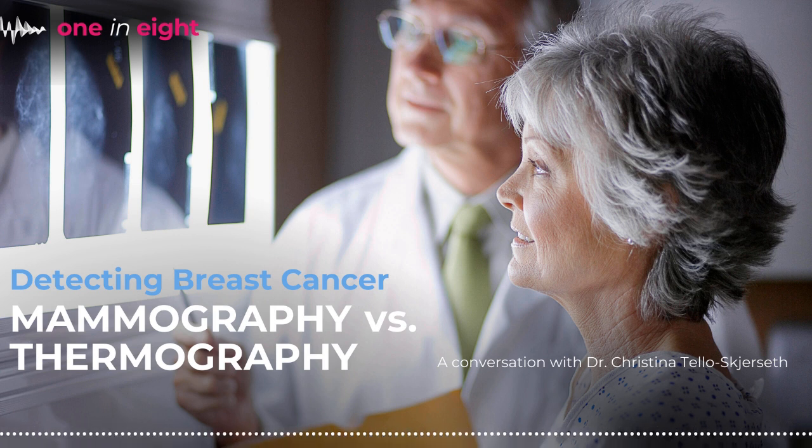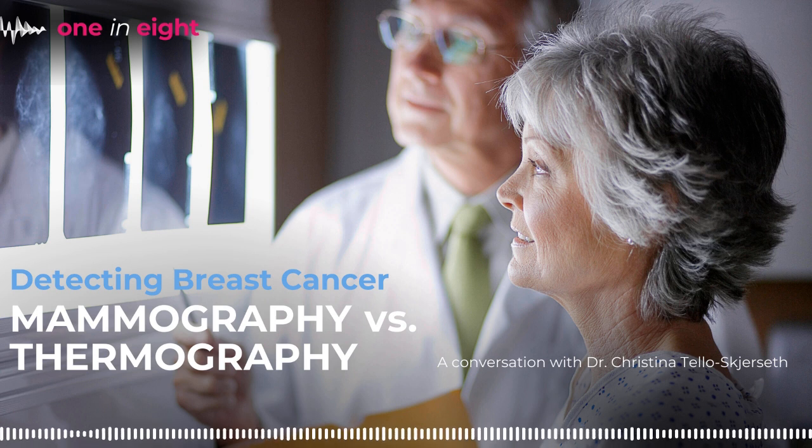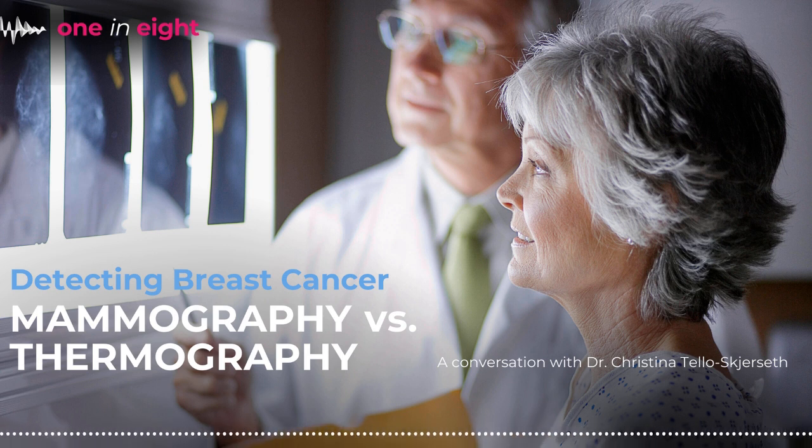And that's really the main, I'll say, advertisement that people use for thermography, that there's no radiation. So there's not an increased chance of getting cancer from that tool. Thermography is also reported as painless because there's not any compression of the breast. That's another one of the, I'll say, harms or downsides of getting mammography, that you are in a compression paddle. So some people are really sensitive to that, and it can hurt. For the most part, having them myself, I would just say it's uncomfortable, but it's just for a couple of seconds. And there's no long-term damage for that.